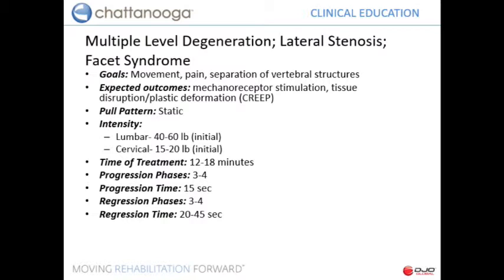So that's a great opportunity to create tissue extensibility, and then potentially, if you're working on a McKenzie protocol or restoration of a curvature, or at least trying to reintroduce a lordotic curve, say, into the cervical spine or the lumbar spine, we've actually found this to be a really comfortable approach and enhancing the possibilities of creating that opportunity when the patient completes their spinal distraction prior to doing their extension types of exercises.